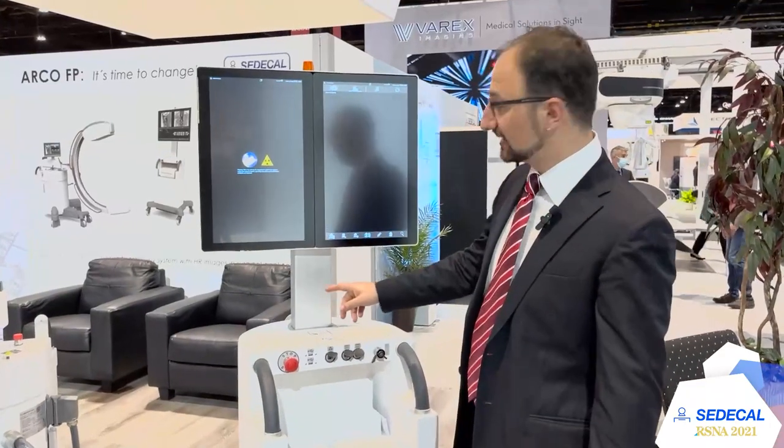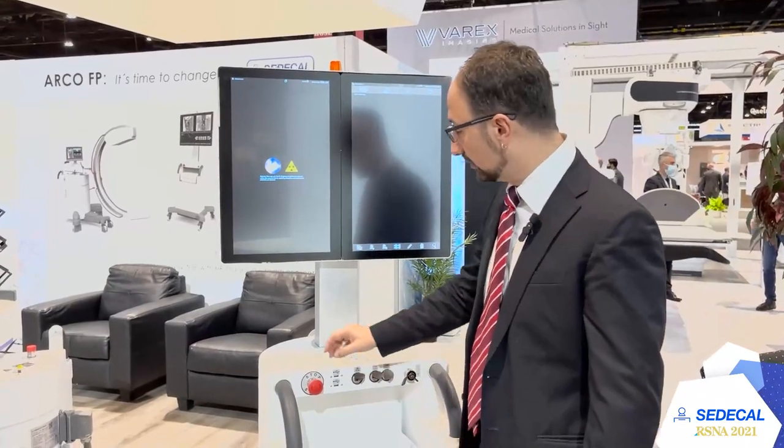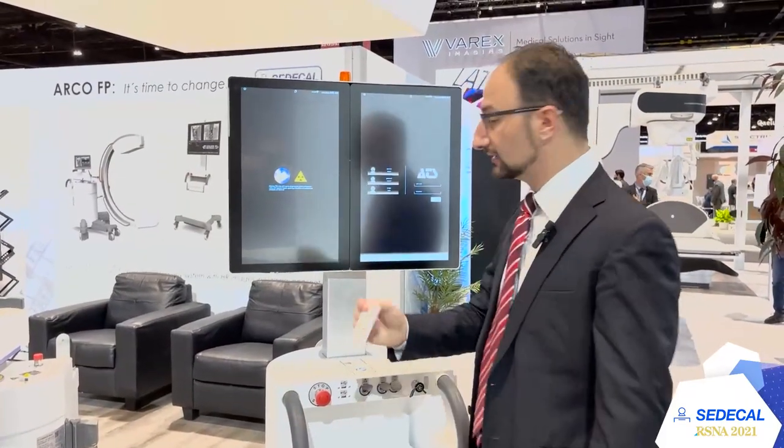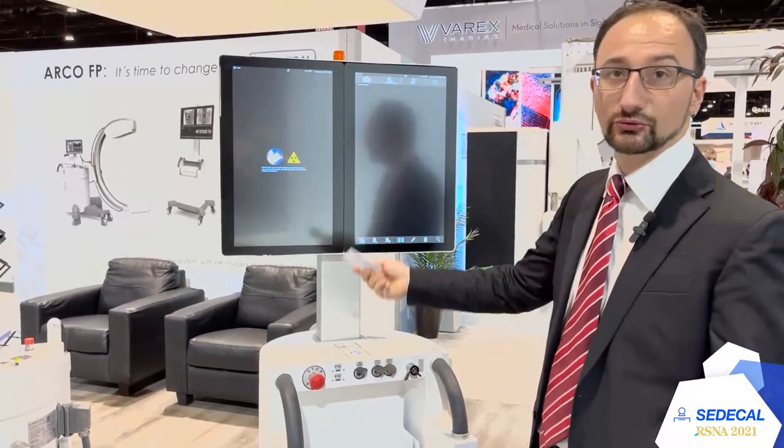When you switch on the system it's possible to log in manually. You can create operator accounts as needed, or you have the option to log in with an NFC card — just place the card here and you can log in and start to work.